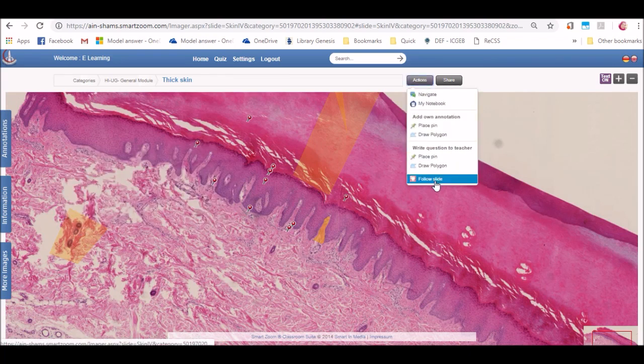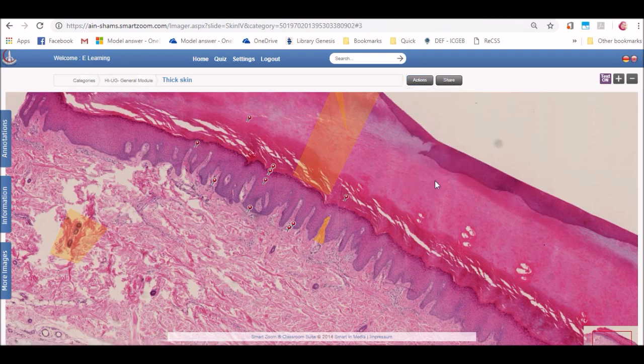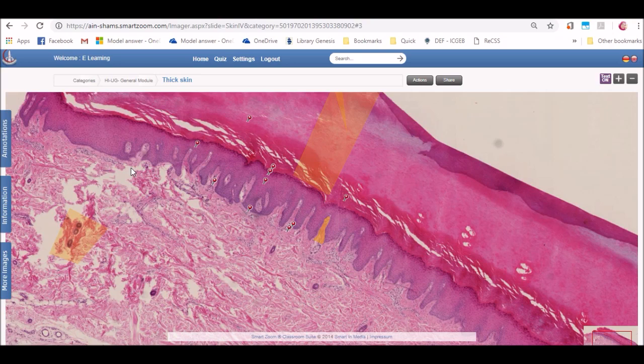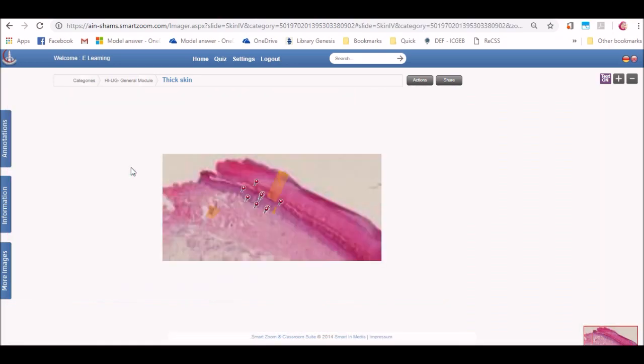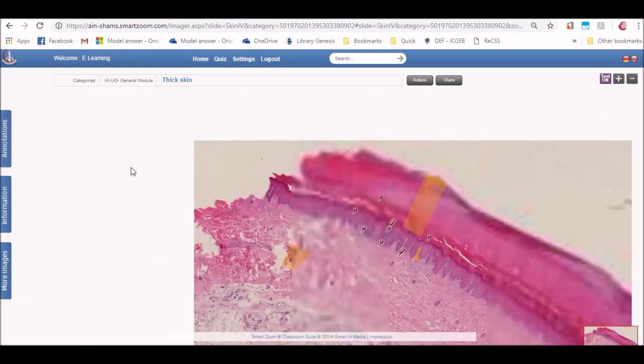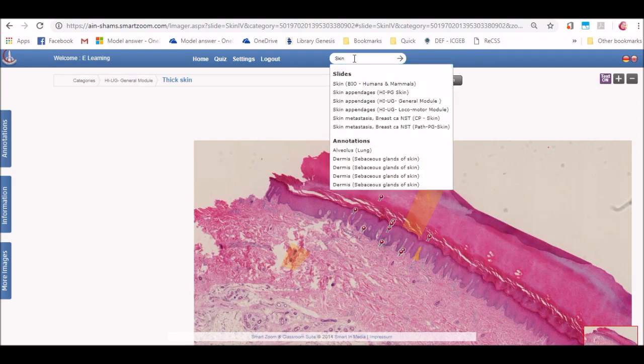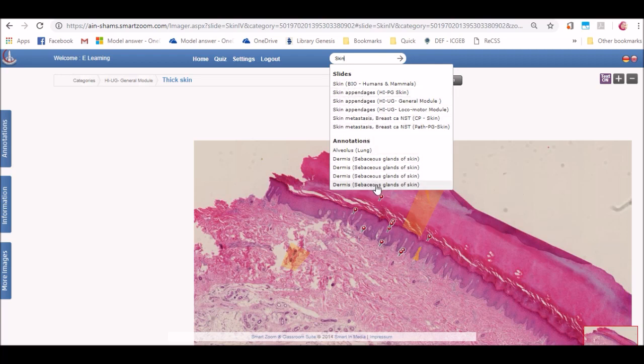The last feature is that you can follow the slide and any update on the annotations will be sent to you. In the search bar, if you typed in any keyword, it will bring you a list of the slides and annotations that includes this keyword.